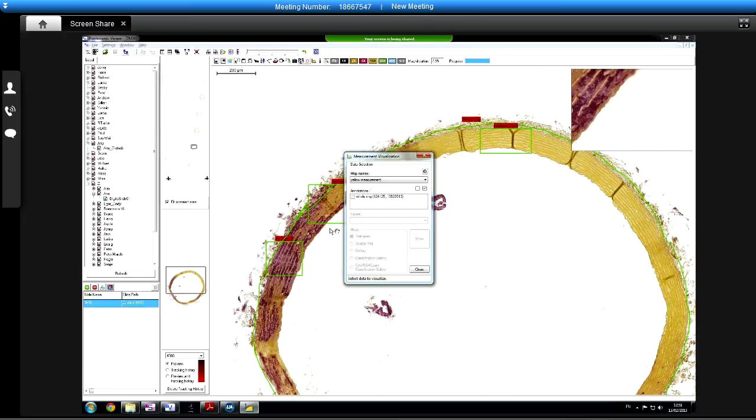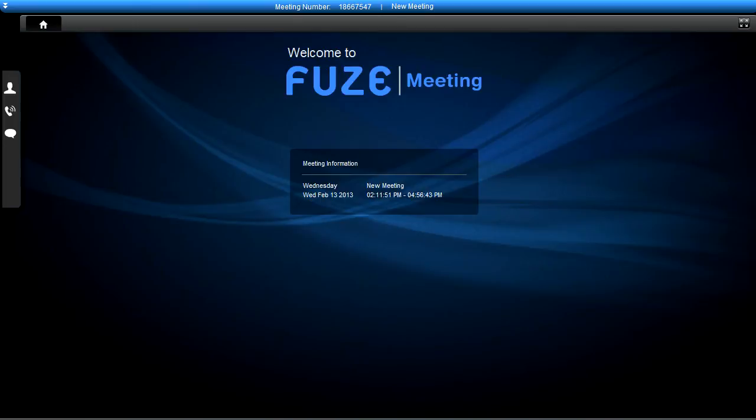Okay, if that's okay then we'll stop for now. Shall I stop this thing recording now? Yeah, that's right. Quite long enough already, I think. Is there anything else? Any other questions you have at the moment? No, the only things that were separate to this were just about the... Okay, well we can do that separately. We can do that separately then, yeah. Okay, I've got your hard disk here. So everything we've done with you is in your network drive. Yeah. And your stuff is on your hard drive, yeah.